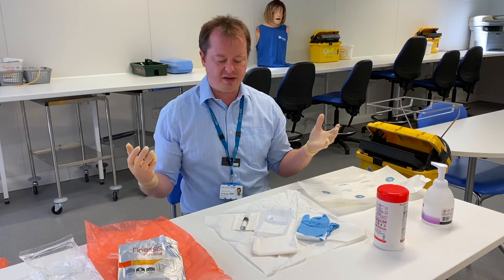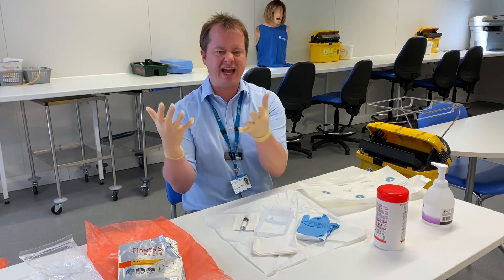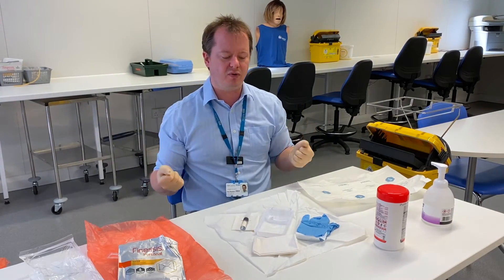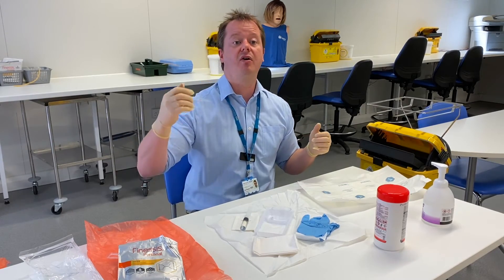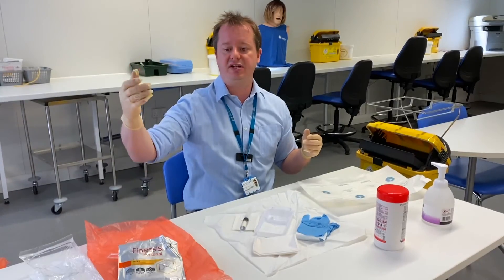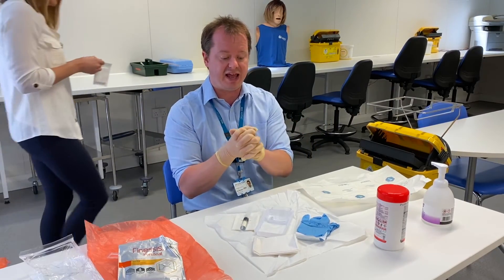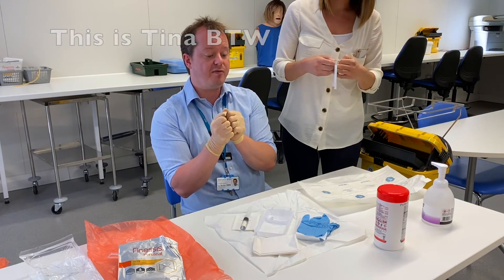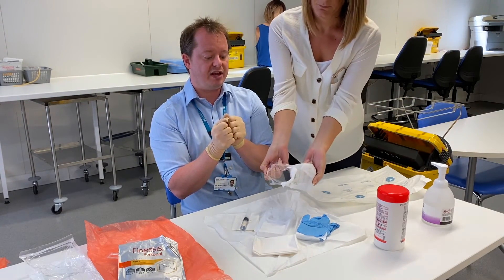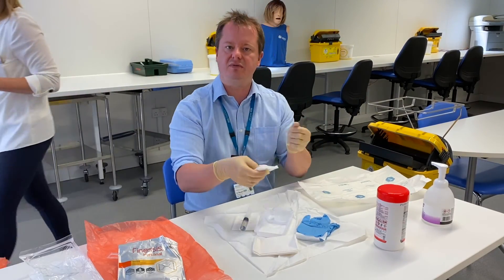Now you might get to the point where you think you've done everything but you've forgotten one important part. If you've done that, you will need to contaminate yourself in order to open it — for instance, some gauze. So you could do that and then replace your sterile gloves, or you could ask your colleague to come over and place the product on your sterile field. They just need to let them open the packet and hopefully drop it right in the middle of your sterile field, and then you can grab the product and do whatever you need to do with it.